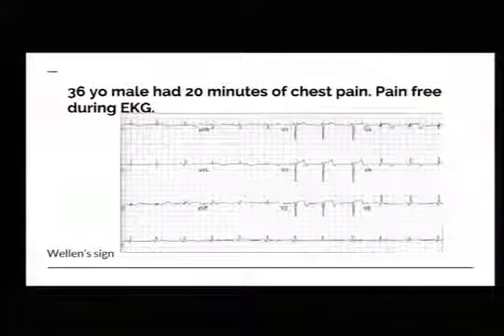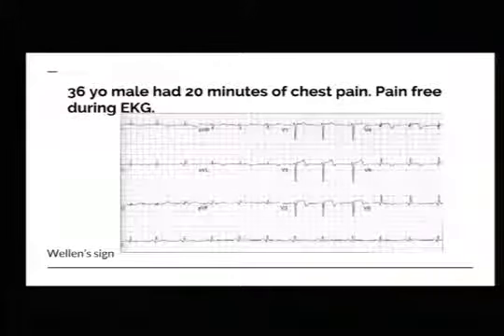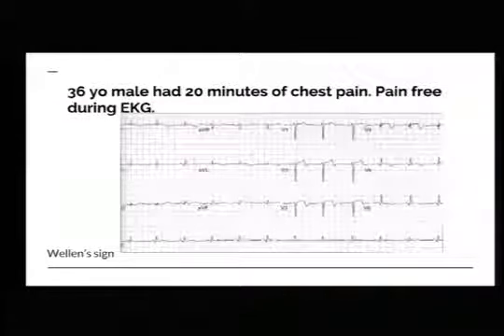This guy, he's pain-free. He's not wanting to come. He feels fine now. These are the guys, though, that you have to try and convince, and when in doubt, call us, get us the 12 lead, and let us have that conversation with the patient to say, these are bad, bad things, and you can be dead in the next few weeks if we don't treat it.